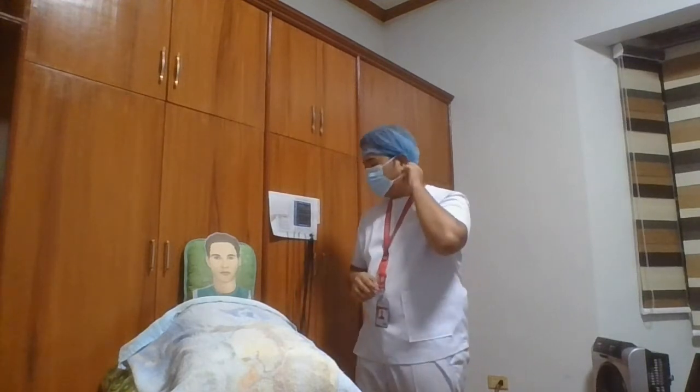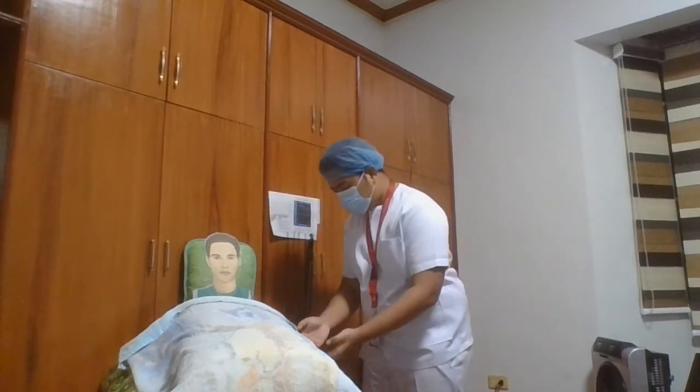And then after that, I'm going to identify the patient by checking his ID band. We're going to ask him to state his name and birth date. Sir, may I check your ID band? And then after checking the ID band, we need to make sure to ask him to restate his name and say his birthday for confirmation.